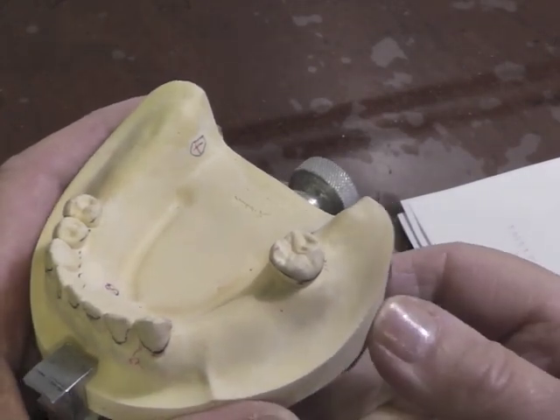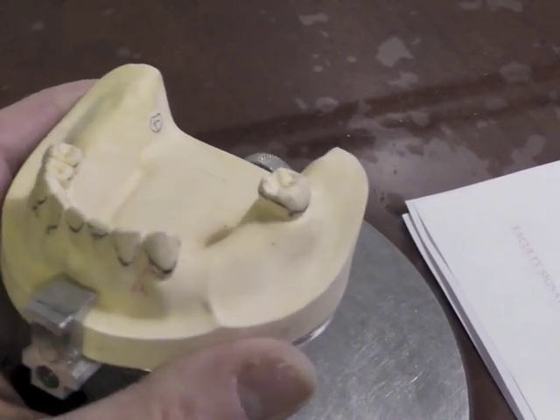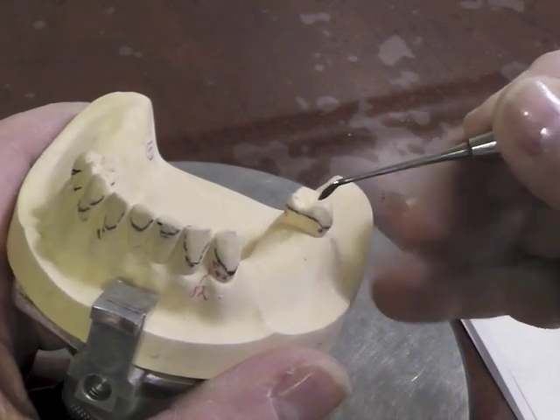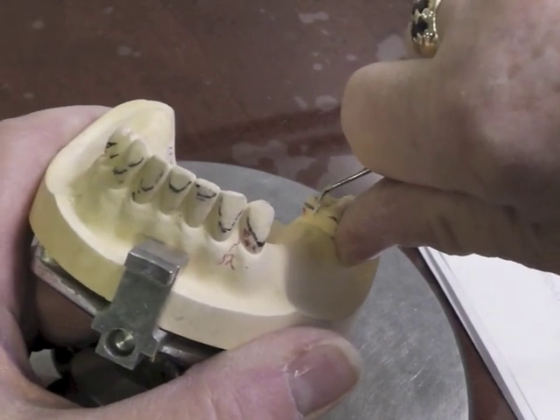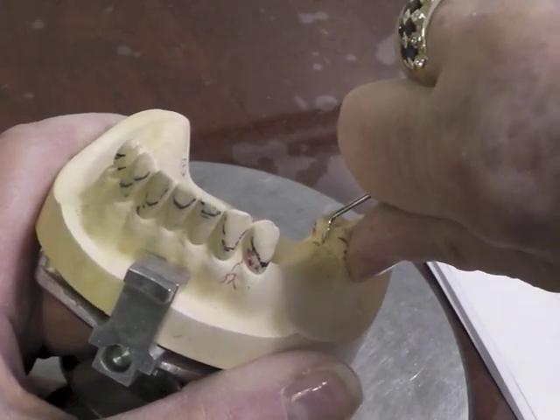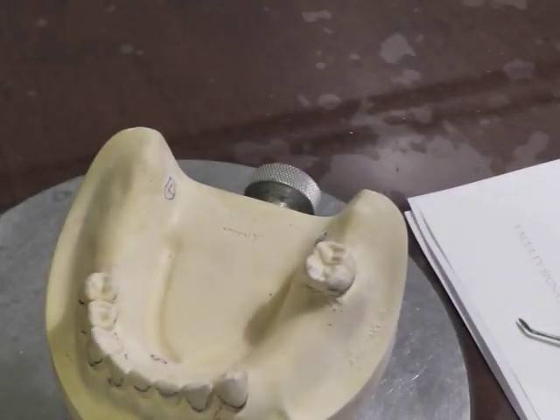Let's go ahead and transfer our design onto the cast. The first thing I like to do is place my direct retainers. I'm going to have a ring clasp on this particular tooth, and it starts out with a guide plate and a mesial rest. The first thing you should prepare is your guide plate because you want to lower that survey line. You want the guide plate to be just from the marginal ridge, approximately two to three millimeters apical to the marginal ridge, and you want your survey line to come out at that position.